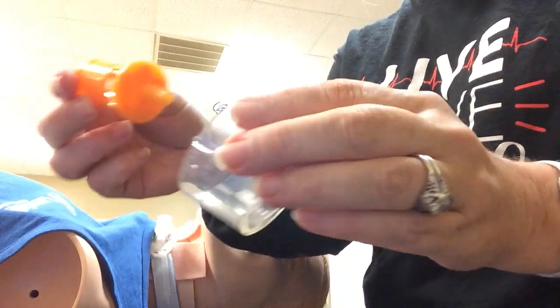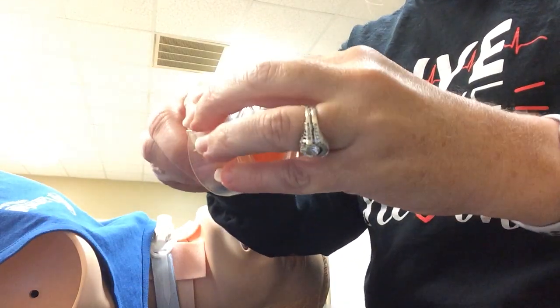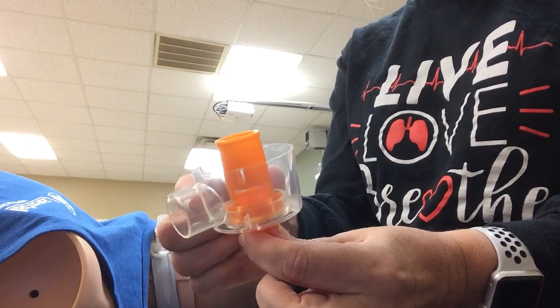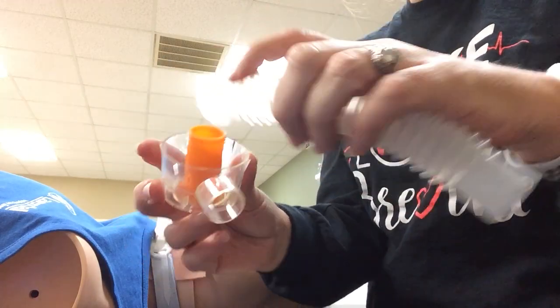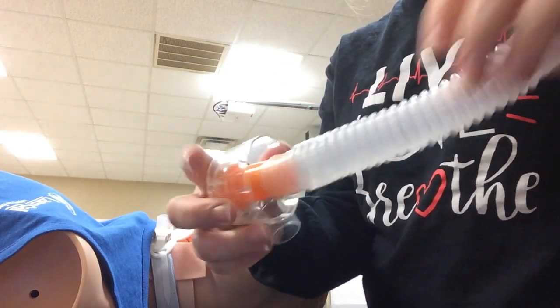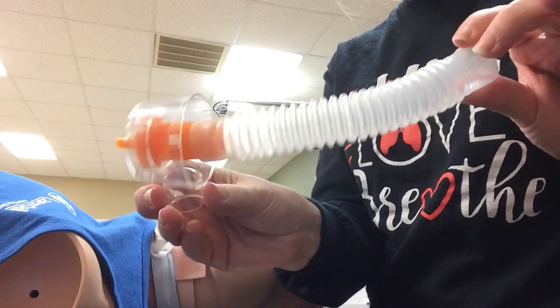The venturi part is going to go in the aerosol collar like this. Remember, it protects the air entrainment port, so it's going to fit in just like this. Your piece of clear tubing is going to go right on top like that.